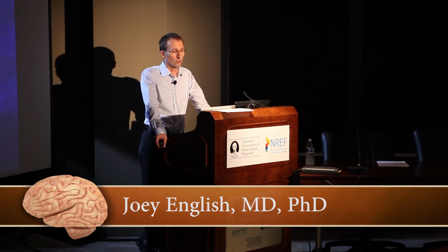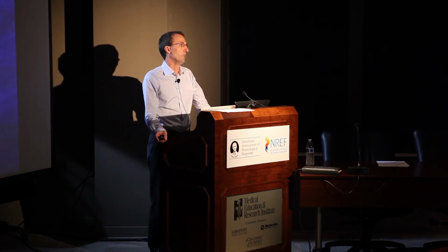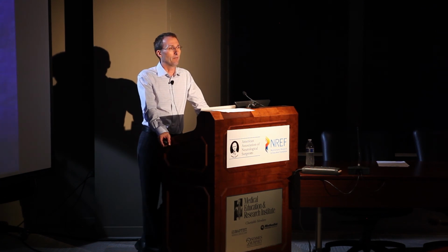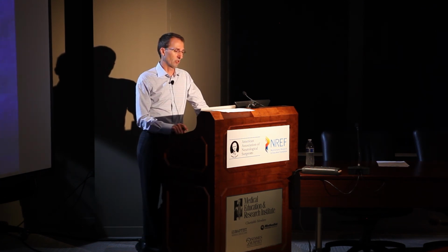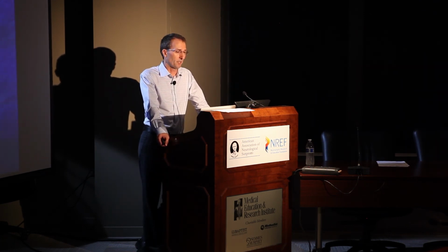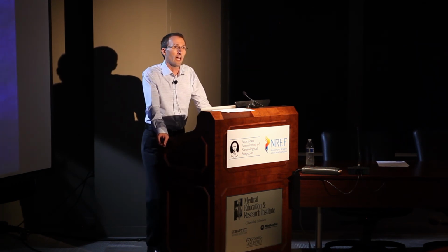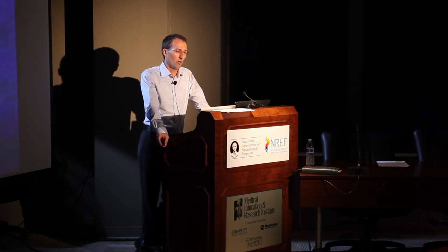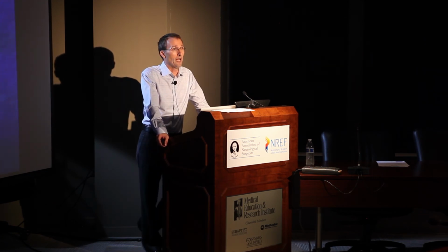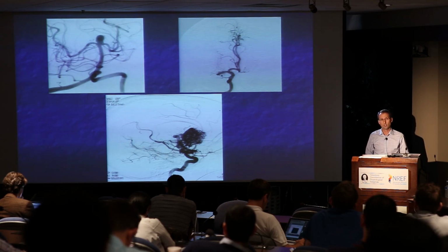They can be technically very difficult. But I would also say that the evaluation of the anatomical challenges and the details of the anatomy are more or less pretty straightforward, certainly with our modern-day imaging in the angiography suite and with cross-sectional imaging. By the time any of these three patients get to the angiography suite, they already have some detailed CT, MR data where we really know largely what we're about to get into. And we probably have thought about how we're going to approach any individual case even before we do a single angiogram. And I will tell you, I think that dural fistulas are very different from that.